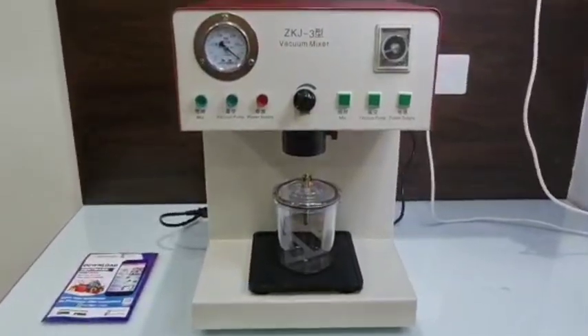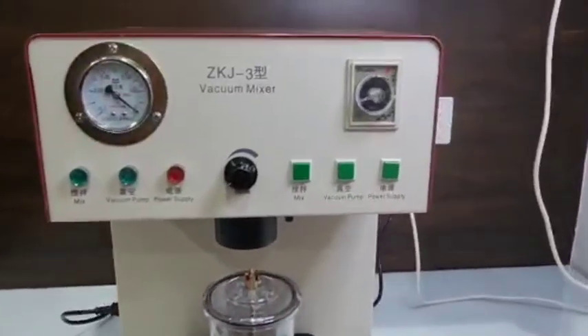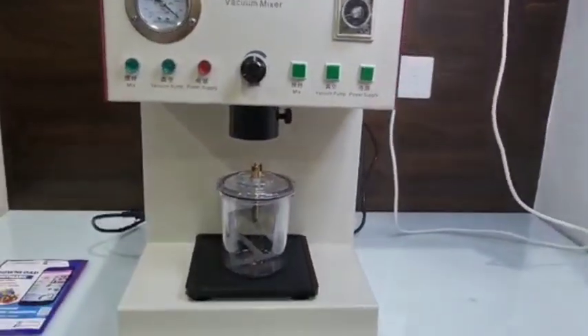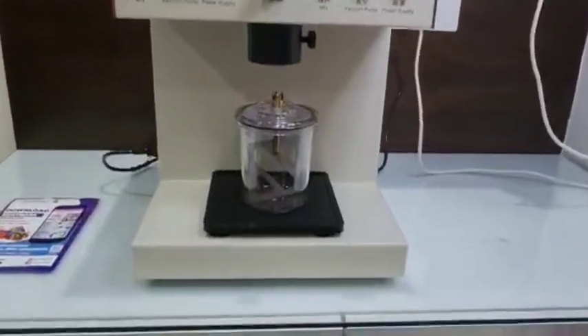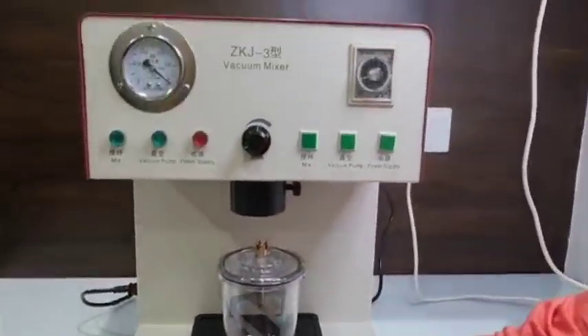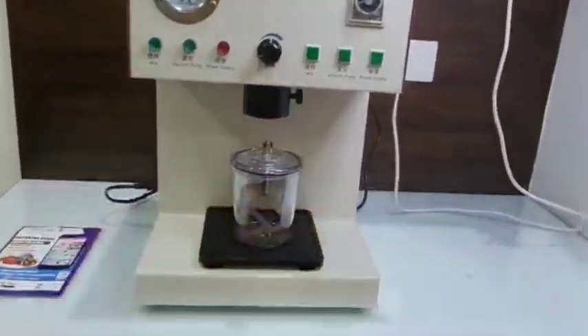Greetings Dentmark peers, presenting to you a machine by Dentmark. This is called a dental vacuum mixer. It comes with an inner pump and also a vibrator. This vacuum mixer with the inbuilt pump and vibrator is used for mixing and vibrating investment materials and molded materials.